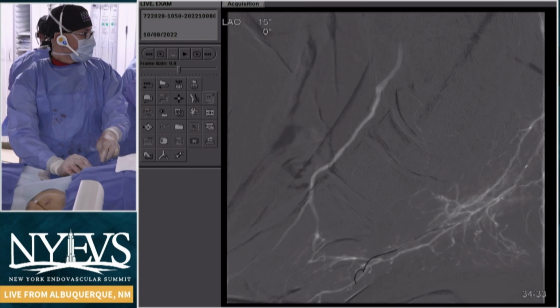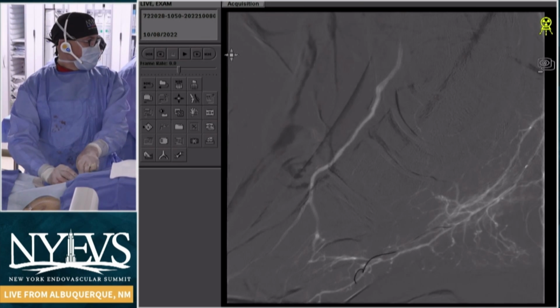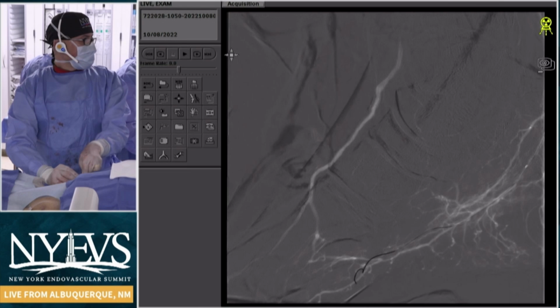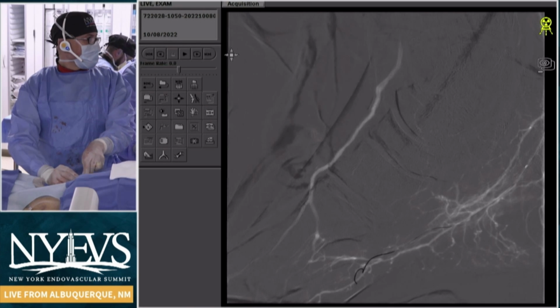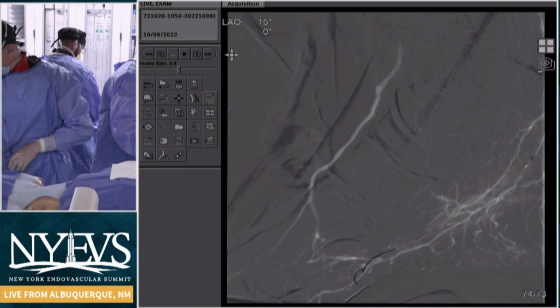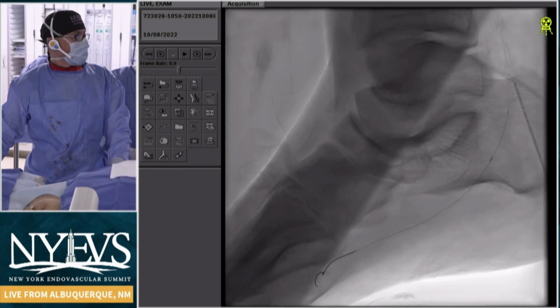When they have more than that, it's usually a hybrid approach where we'll try to revascularize the loop, and then one of our surgical partners will do the transmet or whatever reconstruction they need. So in those situations, that's when we're the most aggressive. What I've heard around the world is that they sometimes will leave the wire in and take them straight to the OR so they don't take out the pedal loop in the operating room.